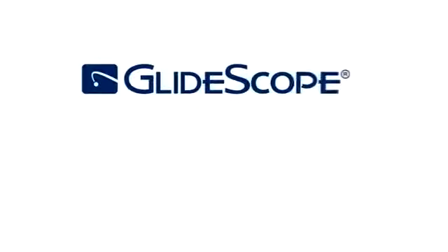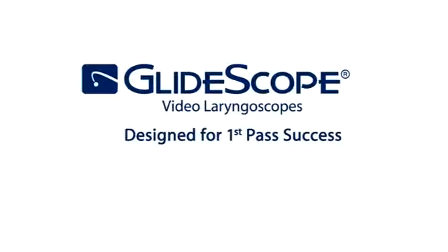GlideScope videolaryngoscopes, your go-to device for pediatric airways.